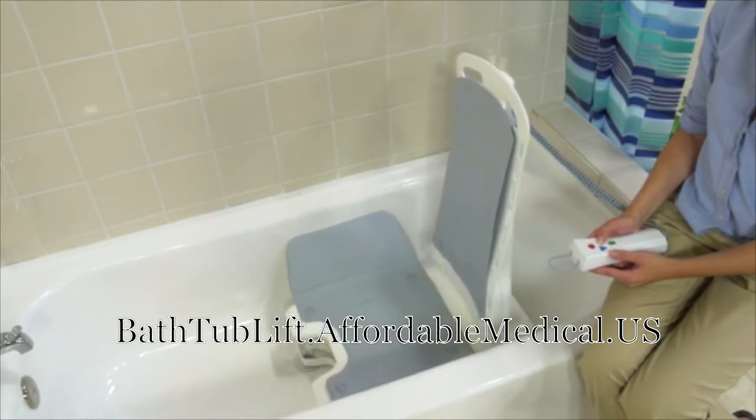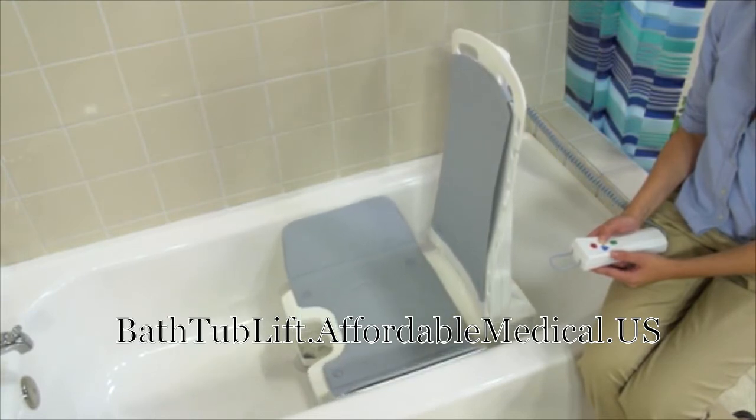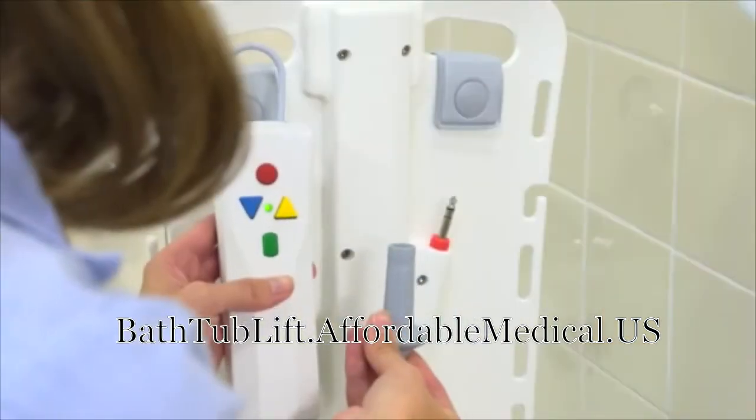This bath lift can lower to 2.3 inches so users get a better soak, and it can rise to a record 18.8 inches, allowing users to get out of deeper tubs with greater ease. When raised, the side flaps create a transfer surface for getting in and out of the lift.